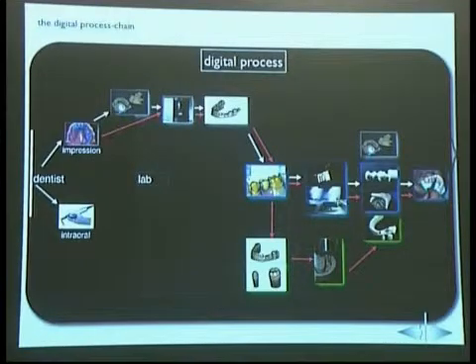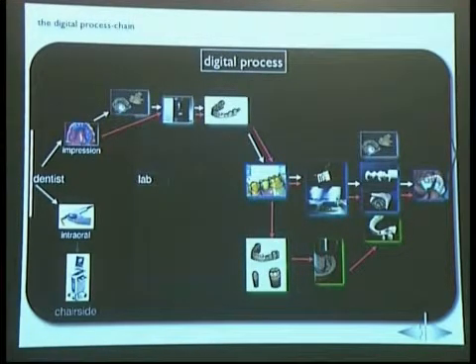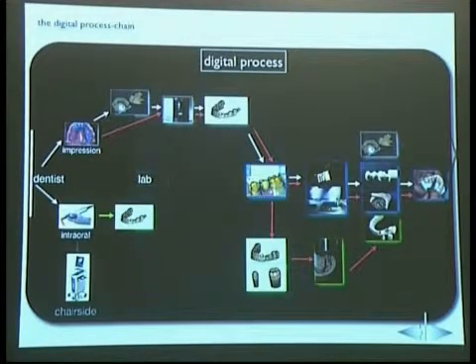And now comes the second step, what's going now more and more, as you saw in the lecture before, more and more into our technology: the intraoral scanner. You have one side of the intraoral scanner, these are the chairside systems, meaning they manufacture directly in the dentist practice over the system. But I think for dental technology, more interesting at the moment is to go the way of making an impression for bigger work, meaning for bridge work, because the sense of such a system cannot be only making single crowns, so it must go in the direction of making a whole bridge.